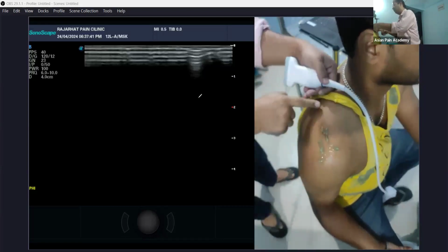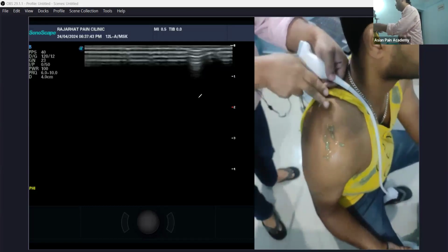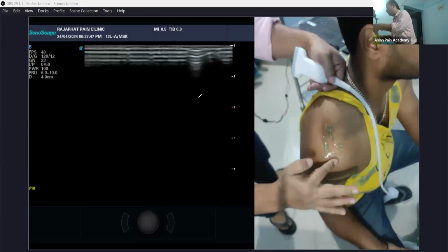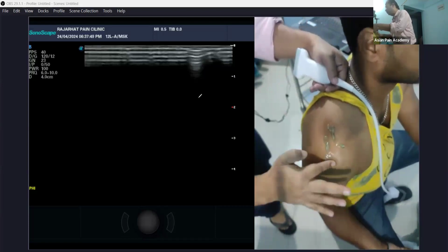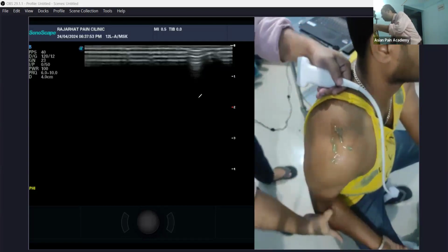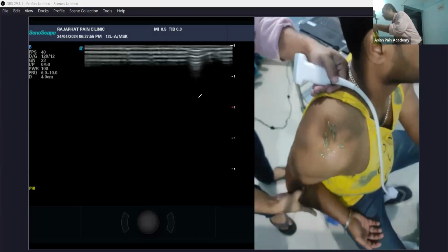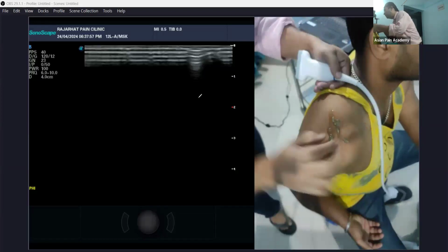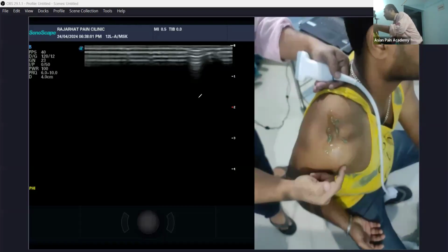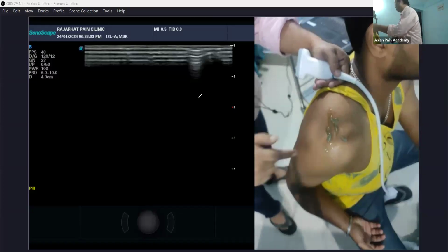from beneath the bone. But now that muscle, supraspinatus muscle, will go like this, and from here it will come out. It is the acromion area. So this is the acromion margin. So it will come out like this. So I will do this type of movement, so that this tendon is pulled out and we see more tendon which is coming and joining in the greater tuberosity. Okay.